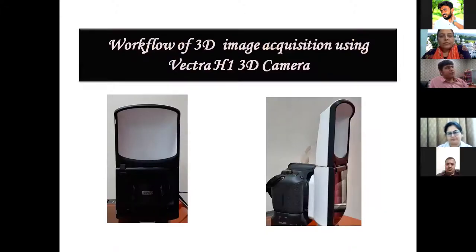Coming on to the workflow of 3D image acquisition using the Vectra H1 3D camera. This camera is what we are having in our lab, and we are using it in a number of cases. The camera is based on the principle of stereo photogrammetry, where two cameras are placed and focus is done.